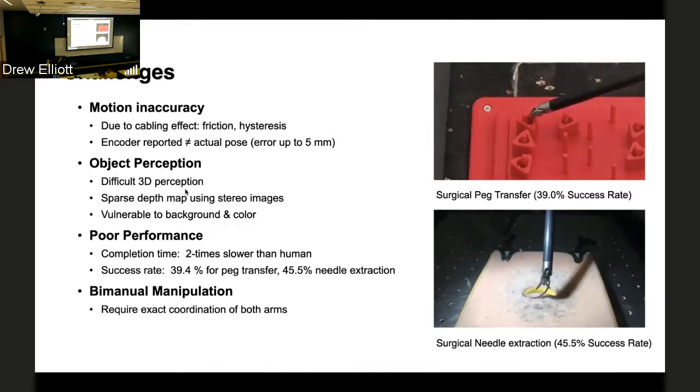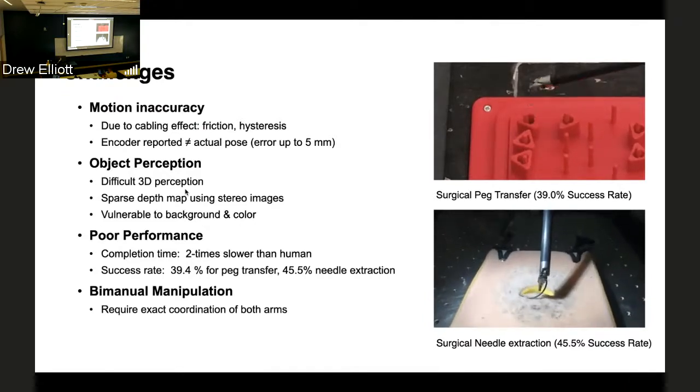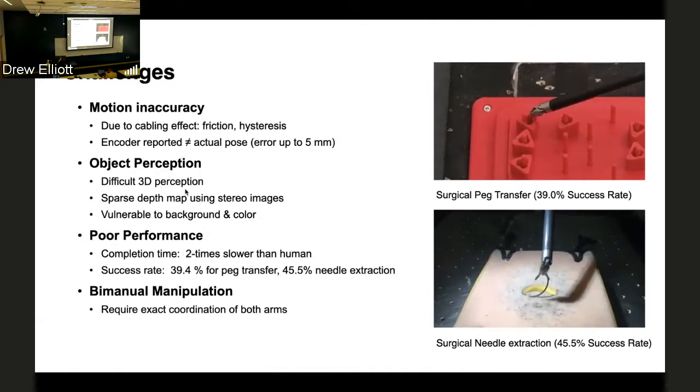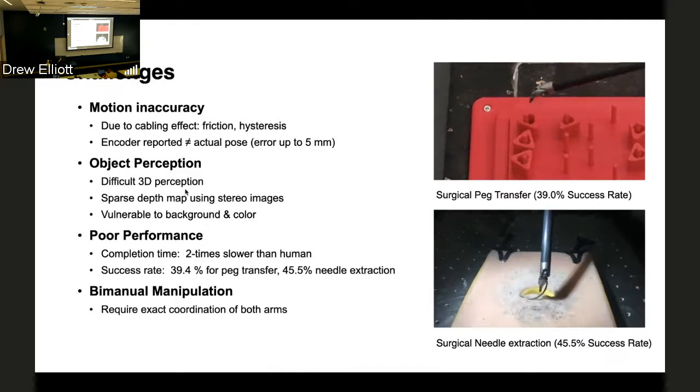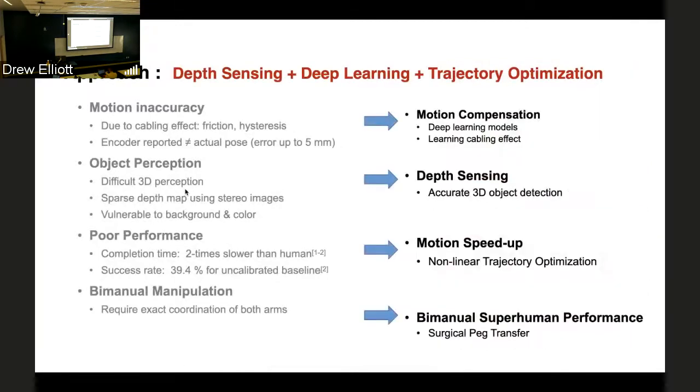And then there is, in the past, there has been some really interesting work on this. Jacob Rosen at UCLA and his group have done some work with the Raven on this problem on fully autonomous peg transfer. They got some pretty good results. And one of the other aspects I want to mention is bimanual, which is to use two of the actuators together and use handoffs.